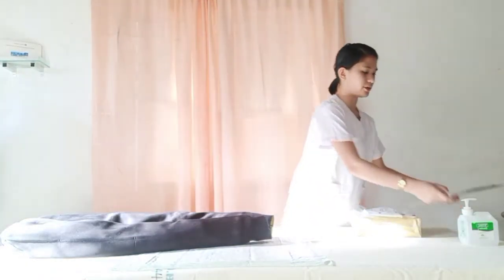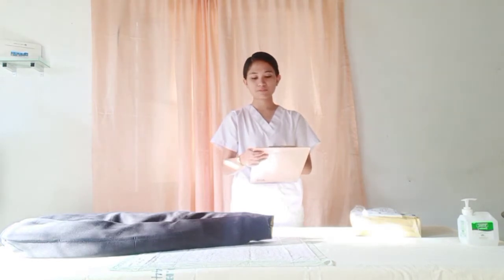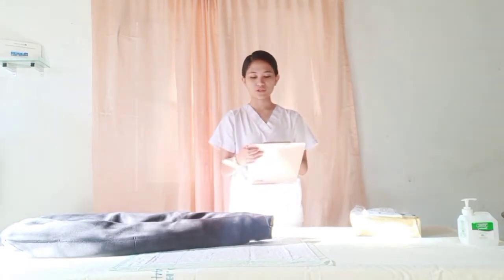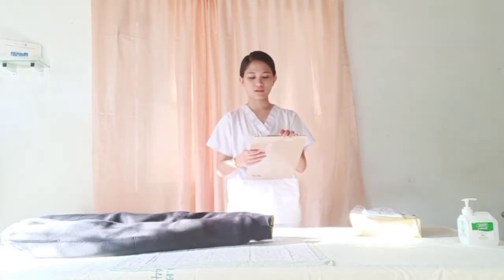Okay, so I have here Mrs. Cruz, 32 years old. I can also see her birth date and her medical number. I am looking at her health history. I can't see any records of allergy to latex products or iodine solution, betadine, so it means that I can use this kit that I have here. I can see that she already had a perineal care routine done by the other nurse.